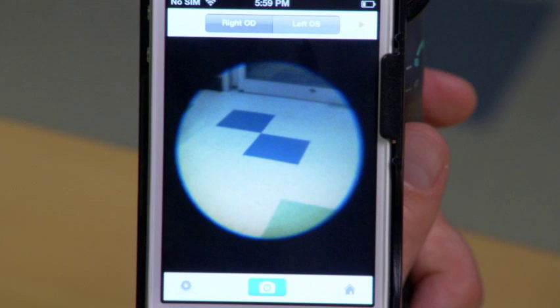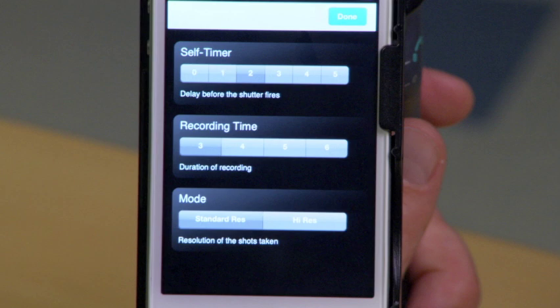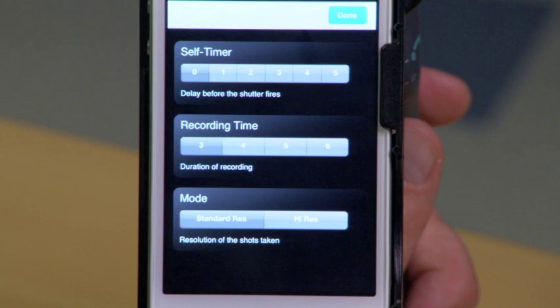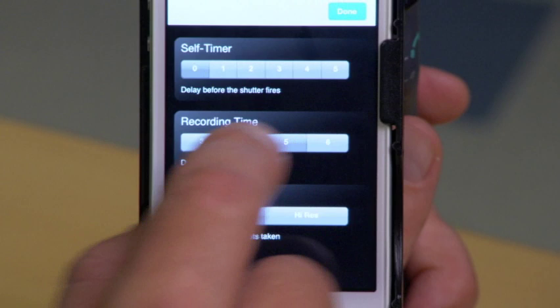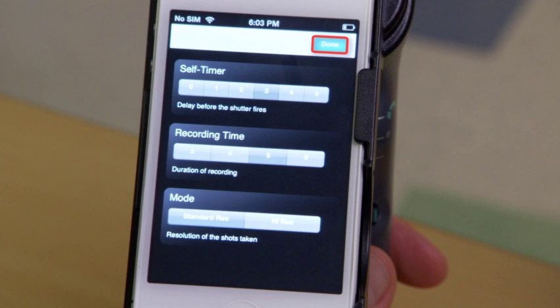To change settings, touch the Settings button in the lower left-hand corner of the capture screen. To change the delay in capturing images once the camera button is released, select the desired self-timer duration — we recommend setting it to zero. You can set the duration of recording images by selecting the recording time duration — we recommend five. Finally, set the resolution of the images by selecting the mode — standard res is recommended. When you've completed your settings, touch the Done button. They will remain as the default settings unless you change them again.